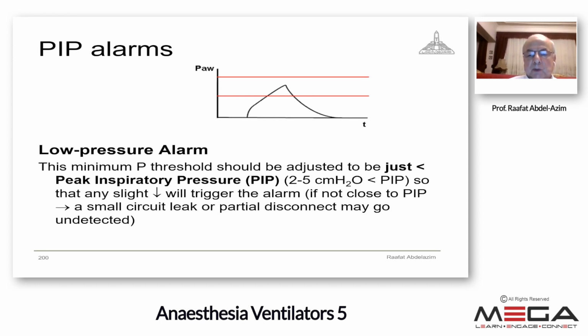If it is too low or if it is not adjusted, if it is zero, it will not detect small leaks or partial disconnection.